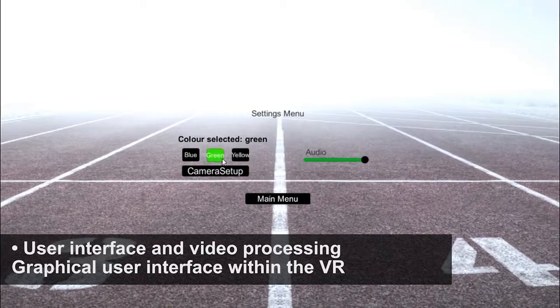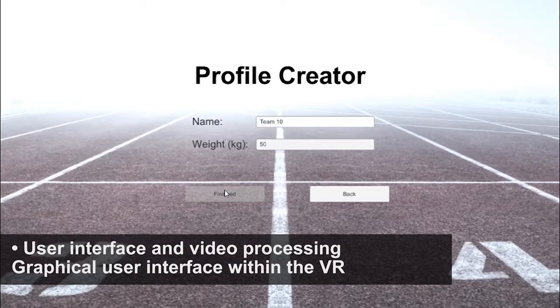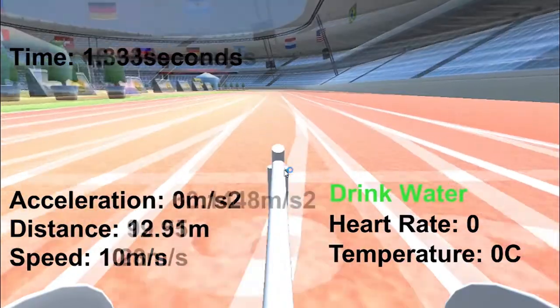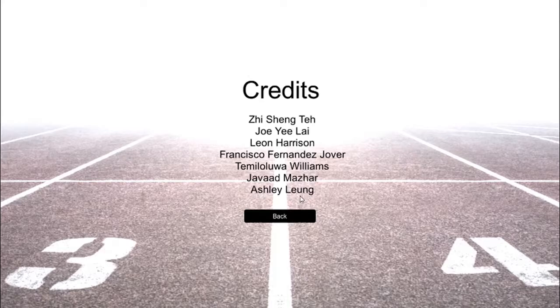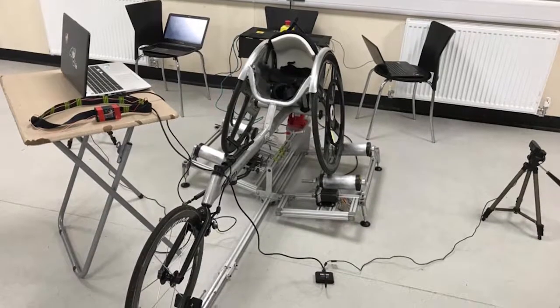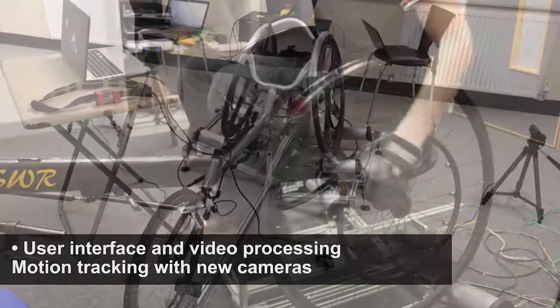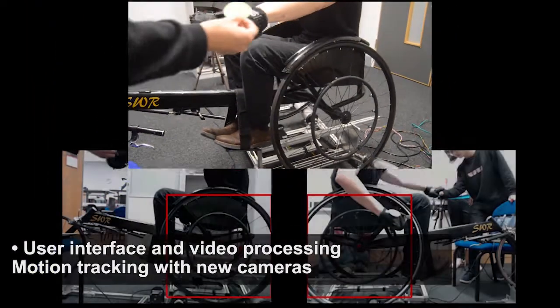The next main aspect of the system is the user interface and video processing, which delivers a seamless interaction with the user and the system. For video processing, motion tracking is implemented with the use of new cameras that can track the athlete's strike rate and strike angle.